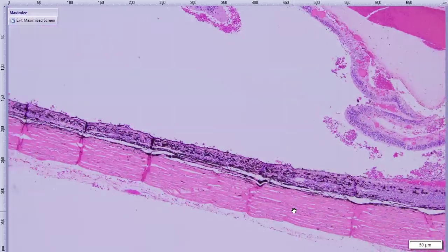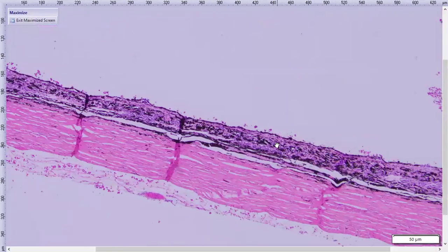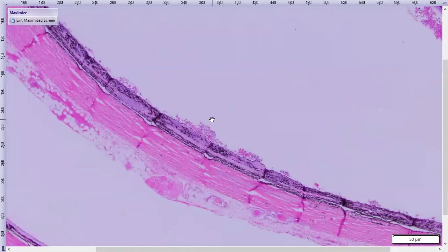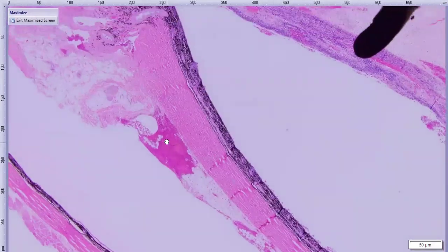And then just to show, here is our choroid. And again, there's just a little bit more cellularity. So there's just more lymphocytes and plasma cells. So we have a panuveitis. And as we move back, I'd point out those plaques grossly, which is likely the correlate to them. There's just these little cellular aggregates on the epichoroidal surface.